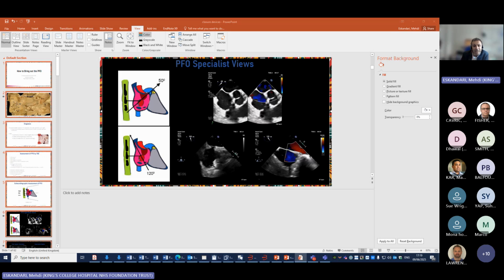If the diagnosis has been made based on the TTE, you often see the flap and the entrance and the exit of that. A bit more angle, about 120, would expose the right upper pulmonary vein, which is always good practice, where you can also see some of the congenital defects such as sinus venosus.